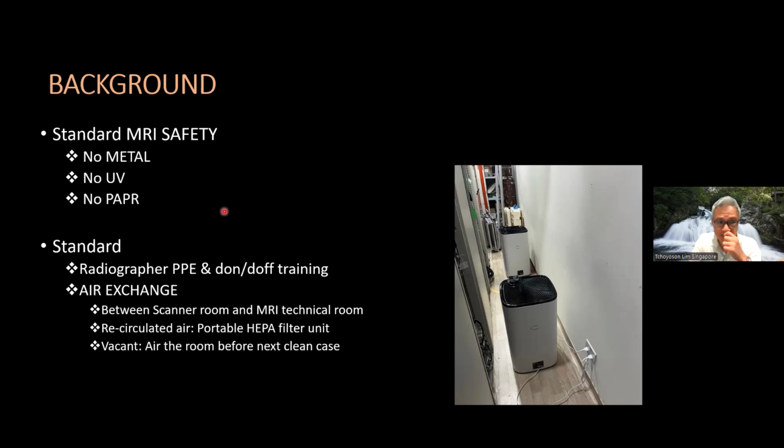This infection control safety measure is layered on top of the standard MRI safety measures, including the metal and pacemaker precautions.